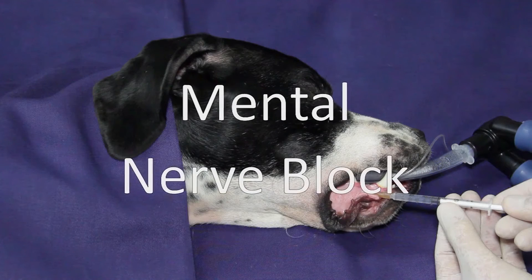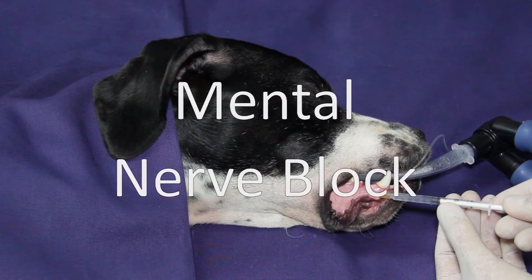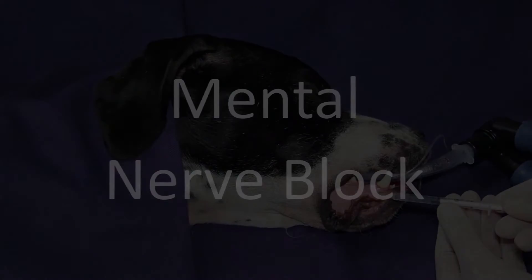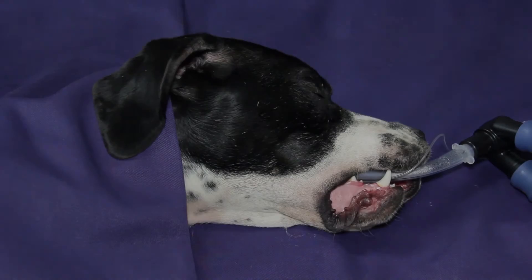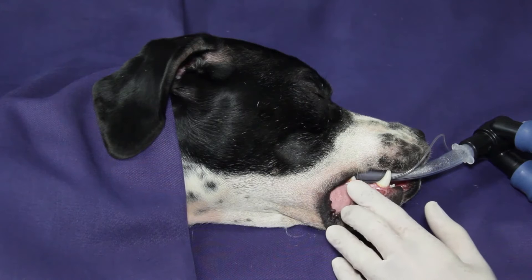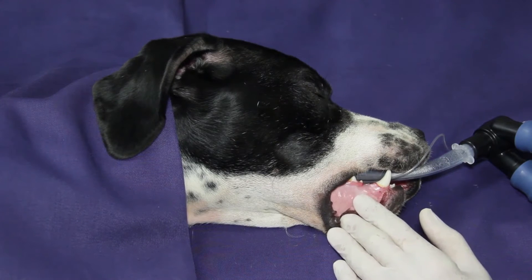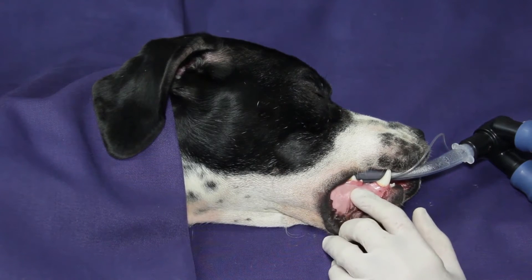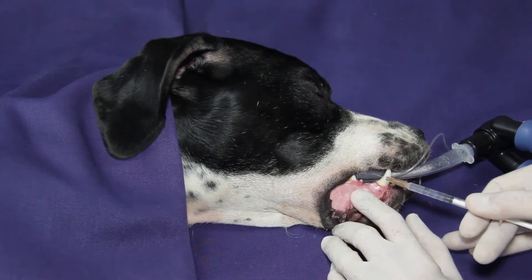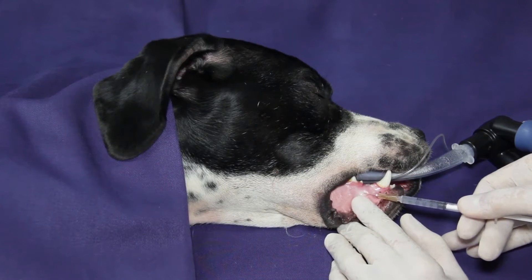The mental nerve block. The mental foramen can be palpated just caudal to the frenulum of the lip, at the level of the mesial root of the second premolar. The needle is inserted at the entrance of the mental foramen, whilst traction is applied to the caudal aspect of the frenulum.